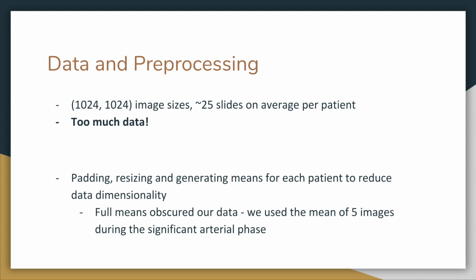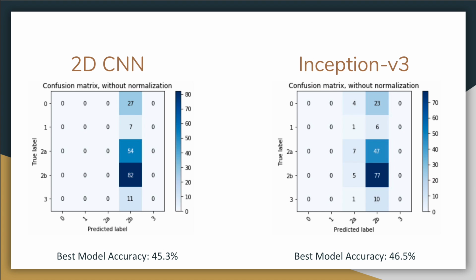learning problem. For the labels, we had TICI scores of 0, 1, 2a, 2b, and 3, which we converted into numerical values using one-hot encoding. Around 20% of the data was missing TICI scores, so we had no choice but to drop those images. After taking the image averages, we went on to build models.